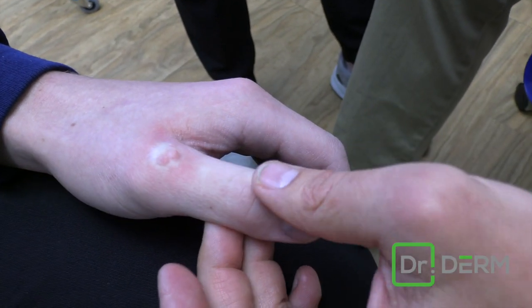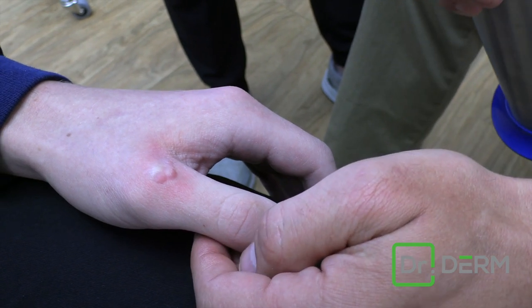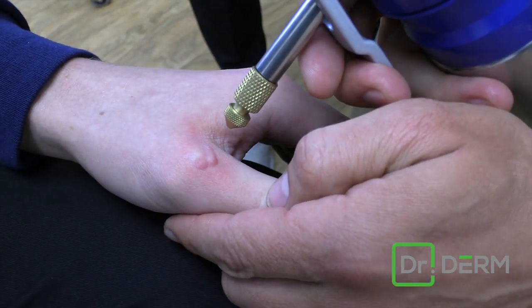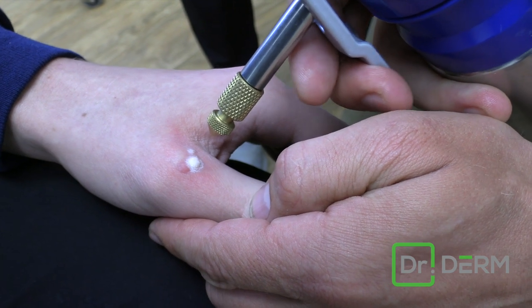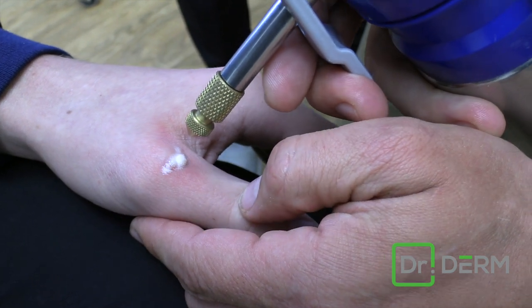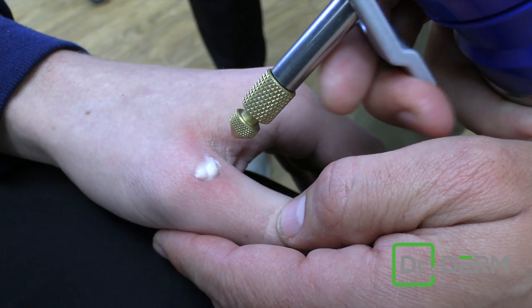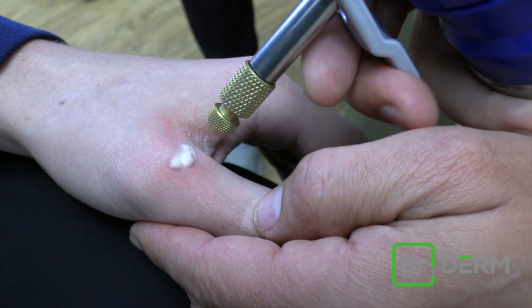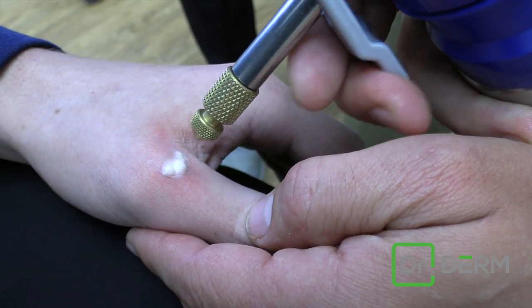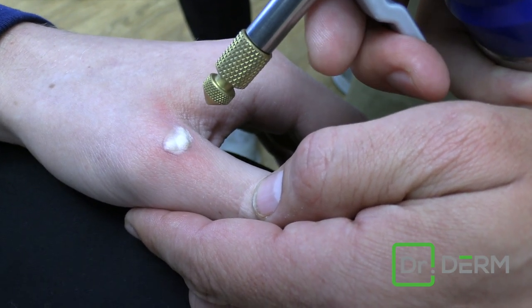So for the second round, it's all thawed down — we waited about 45 to 60 seconds — and I'll just basically do it again. I'm not holding down the liquid nitrogen, I'm just pulsing it. Does it hurt less the second time? A little bit less. It seems like the first round kind of numbs the pain or dulls the nerves a little bit.